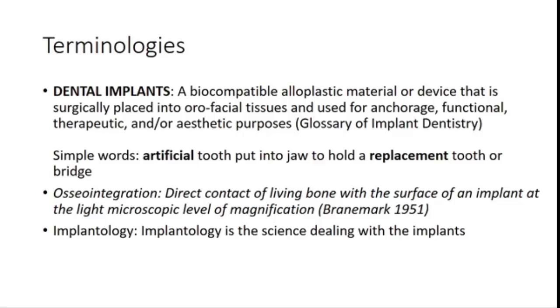Now we'll try to know about what dental implants are. If you go by the definition, it is a biocompatible alloplastic material or device that is surgically placed into the orofacial tissue and used for anchorage, functional, therapeutic, and or aesthetic purpose.